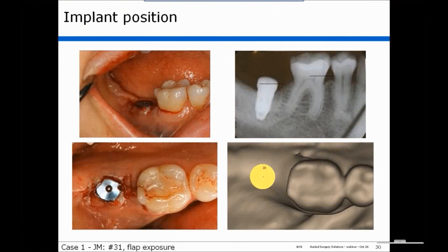Finally, we take a look at the finished case. You can see the implant position, and in the bottom panel you can see that the position of the implant clinically is exactly as it was in the model.